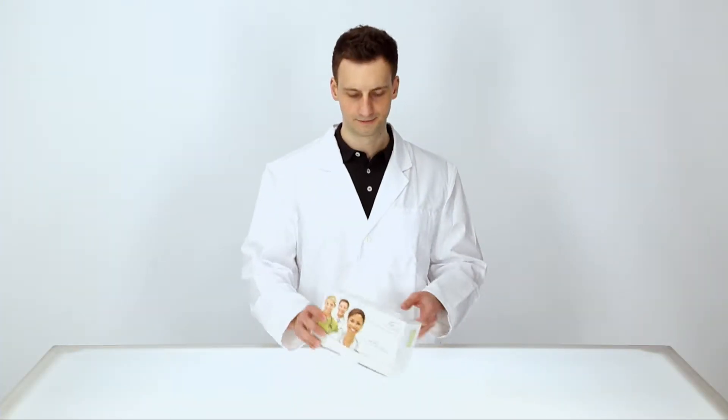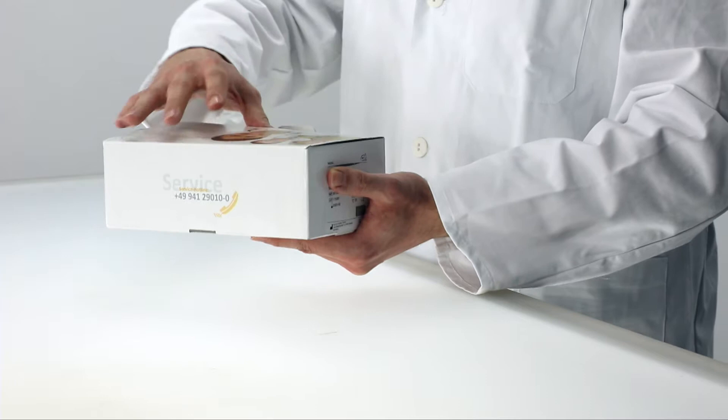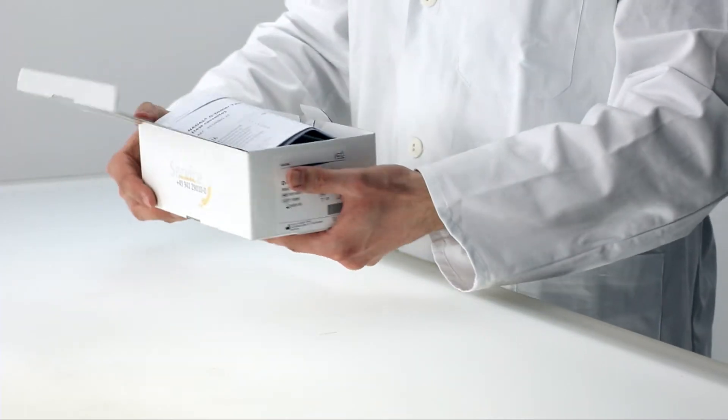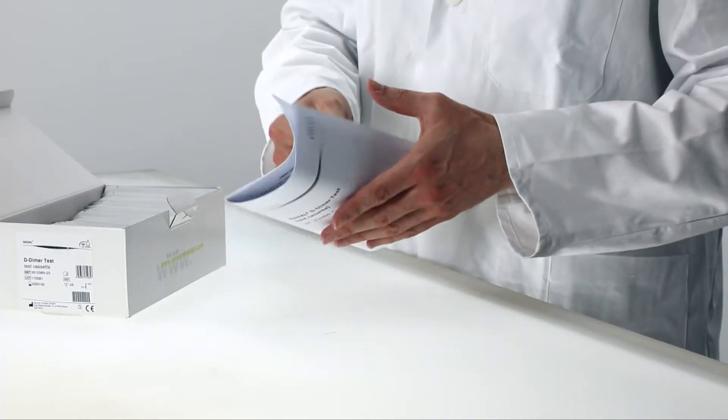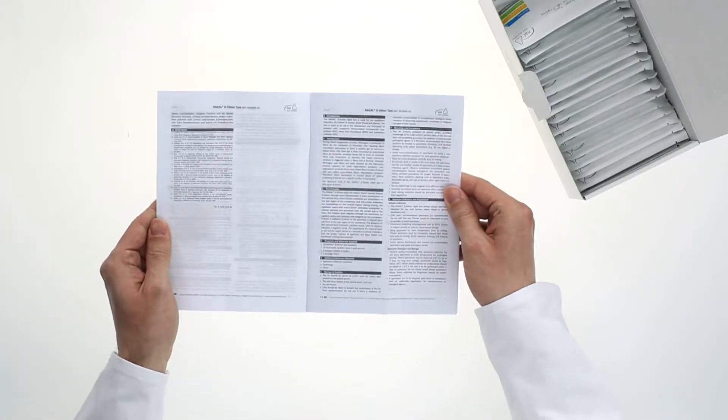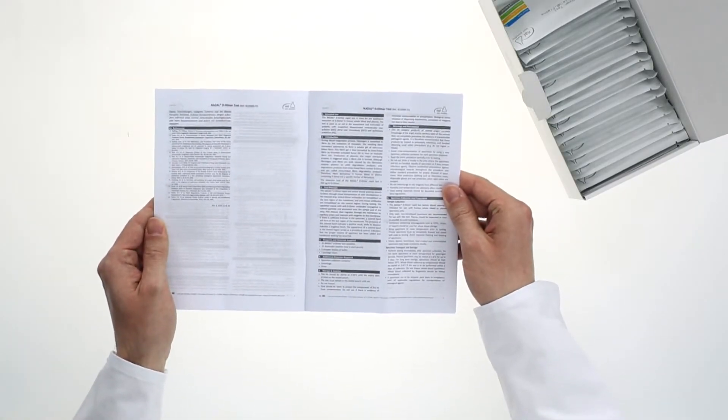The test provides a preliminary result as a diagnostic aid in the case of suspected disseminated intravascular coagulation, deep vein thrombosis and pulmonary embolism. All Nadal rapid tests are based on a similar test principle.